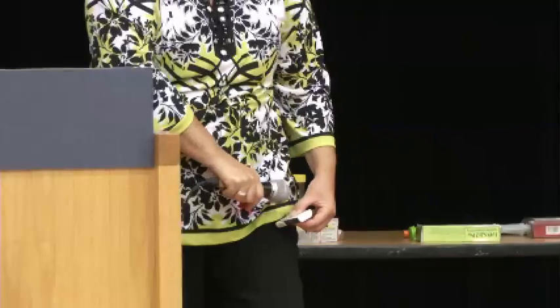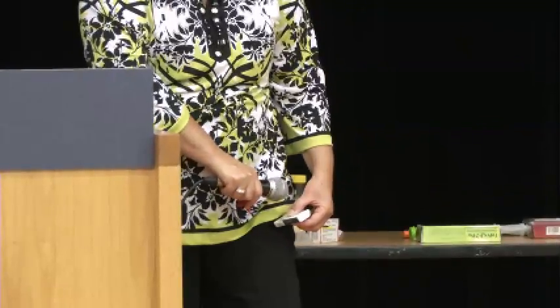So it talks to you. This trainer contains no needle or drug. If you are ready to use, pull off red safety guard. There's only one red end. Not ready to use, replace. To inject, place black end against outer thigh, then press firmly and hold in place for 5 seconds. And there's only one black end, right? So you can't go wrong. Inject. Place it on your thigh, push. Then 5, 4, 3, 2, 1.